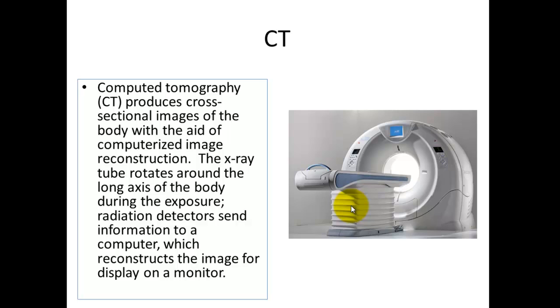That being said, if you take a look at a Tomo cut or CT cut, the slice thickness may be a millimeter, maybe even less. Because you are taking such thin acquisitions, you will automatically get a huge boost in contrast resolution due to a massive decrease in scatter. In addition to having a nice thin cut and reducing the scatter, improving the contrast, your X-ray tube is not stationary, except for perhaps the scout image which you use to plot your other images.